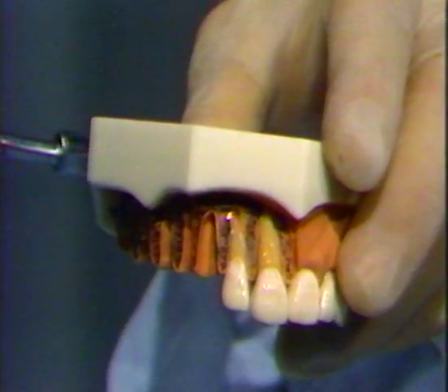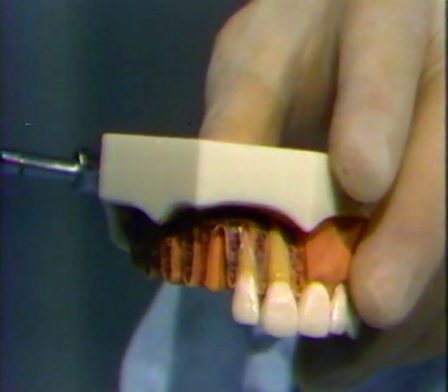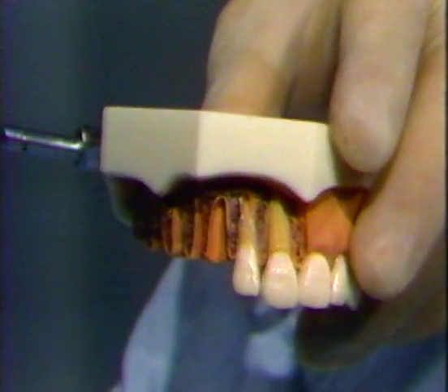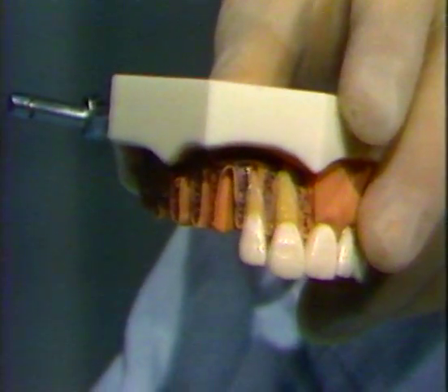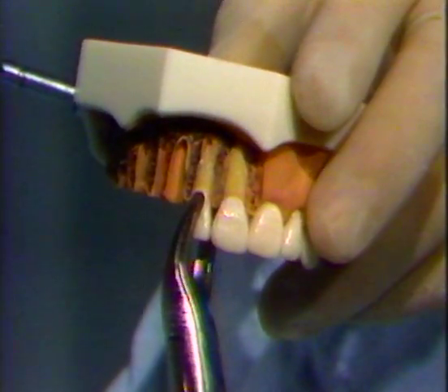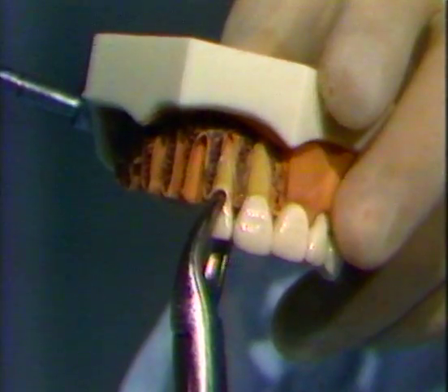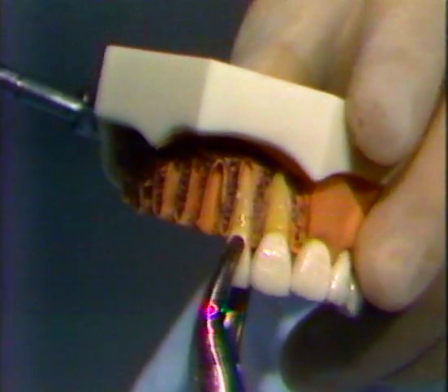This tooth is very thin mesio-distal. Because of this, the operator should avoid rotating this tooth if possible. The first movement for removal of this tooth is to the palatal side, then to the labial side, and finally a downward movement and delivery of the tooth.